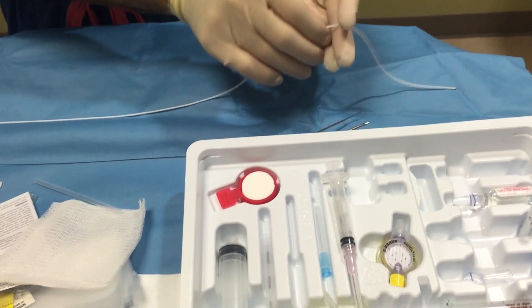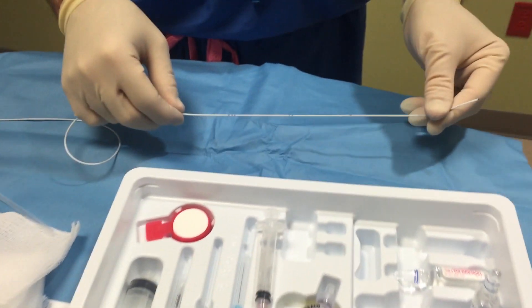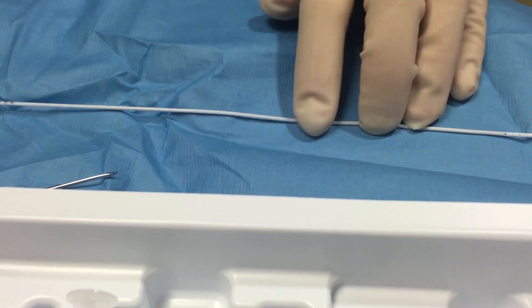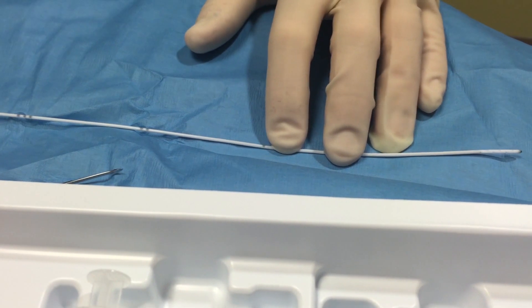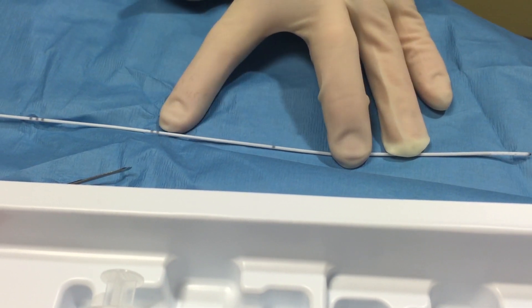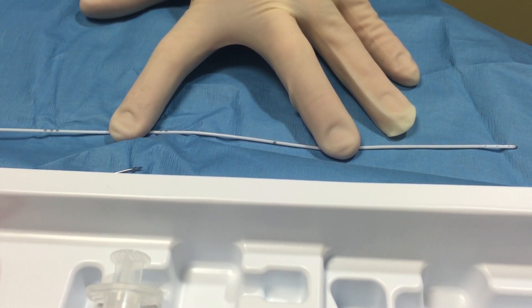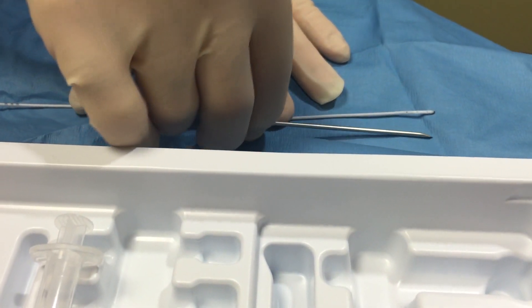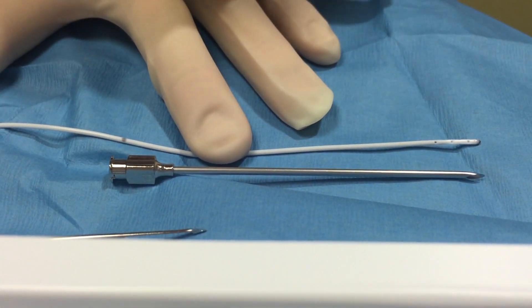Pull your catheter back to your desired distance. Most people leave this catheter further inside the CSF than is typical with an epidural catheter — most use somewhere between 5 and 8 centimeters inside the CSF. It's useful to look at the markings because they're very unintuitive. There's a single dot at 10 centimeters from the tip, a double dot at 15, and a triple dot at 20. That's not equivalent to the way an epidural catheter is marked. You can see that with the needle lying beside the catheter, when the single dot is at the hub, the tip of the catheter is at the tip of the needle.